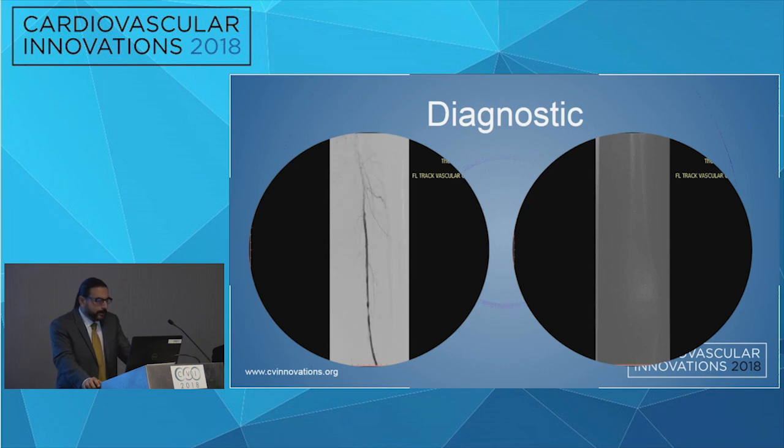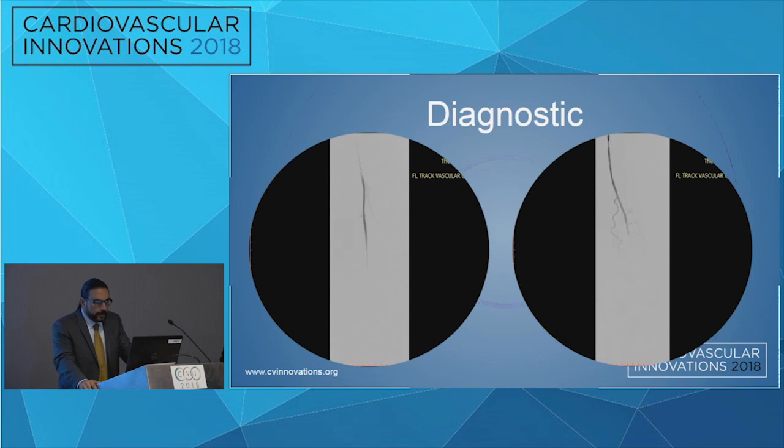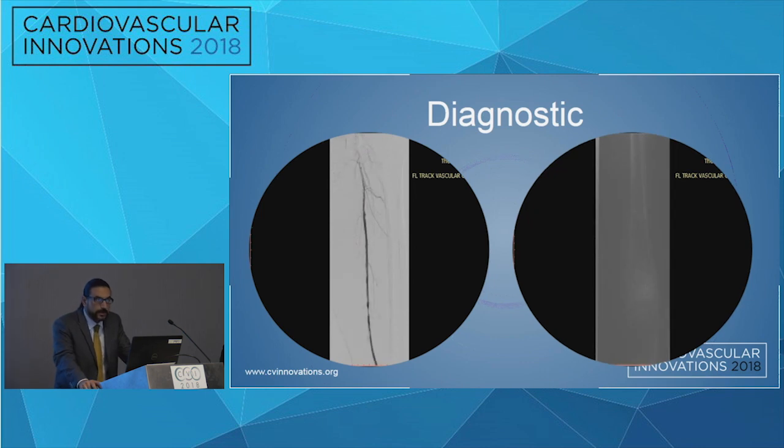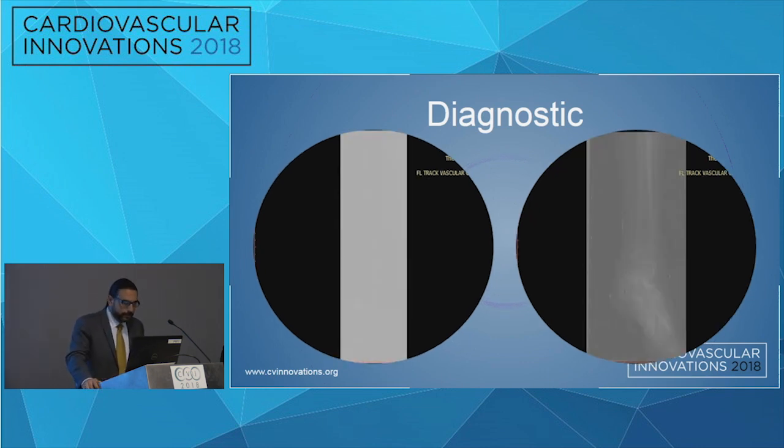Here you can see the left superficial femoral artery. Clearly in the distal SFA there's a lesion, and even more distal at the level of the adductor hiatus there is a popliteal occlusion, a CTO. A lot of collateral vessels. This is reconstitution at the P2 segment, and I'll show you the runoff, which is clearly the most important.